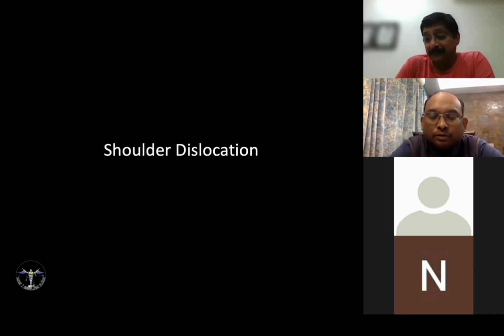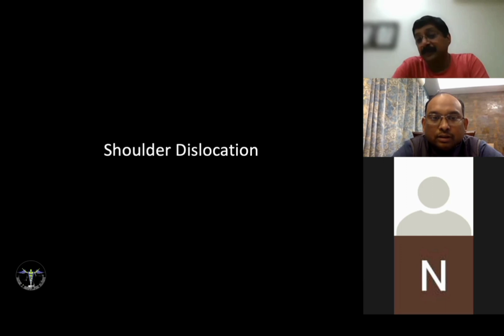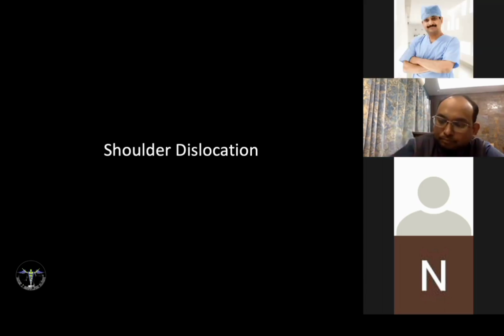Whenever we talk of shoulder instability, the two most common things which come to our mind, both the clinician as well as the radiologist, is whether there is any abnormality in the glenoid, and whether there is any abnormality in the humeral head. These are the two components which form the glenohumeral joint. The instability basically happens in this joint, and the major components are the glenoid and the humeral head.